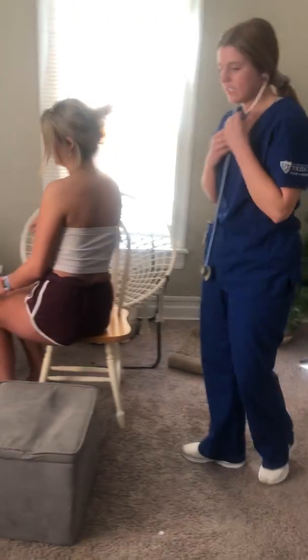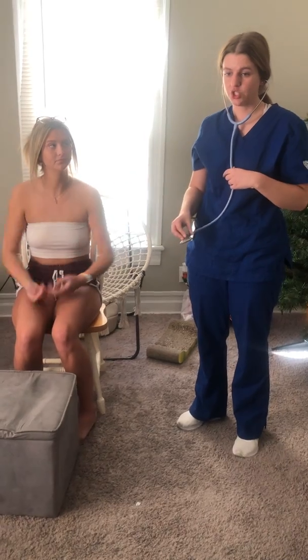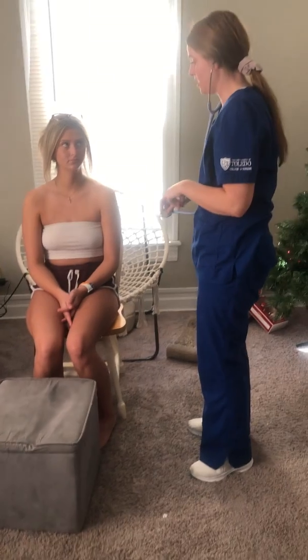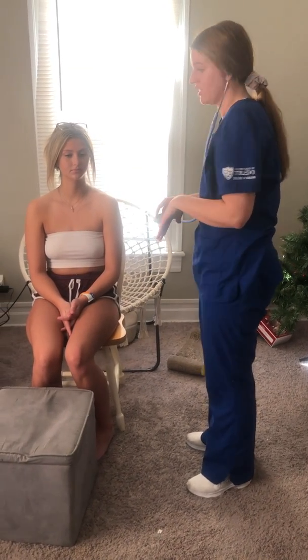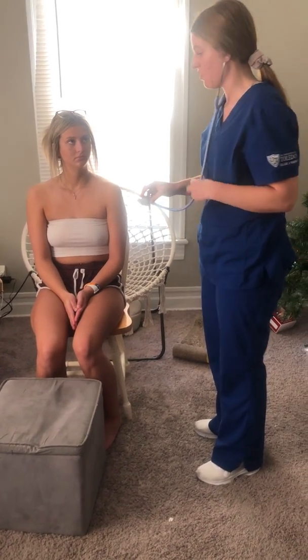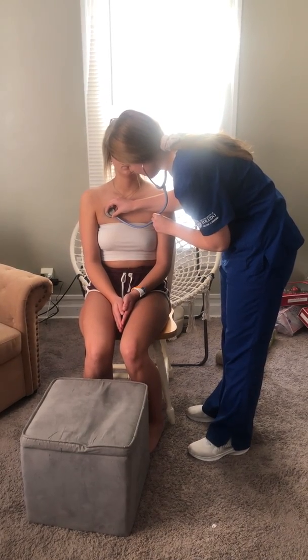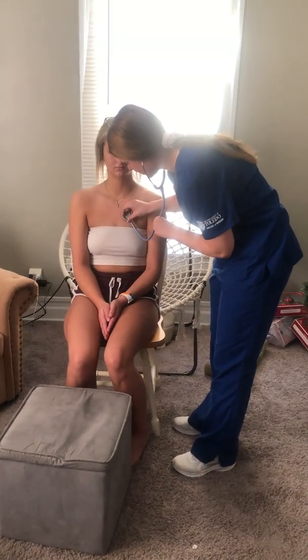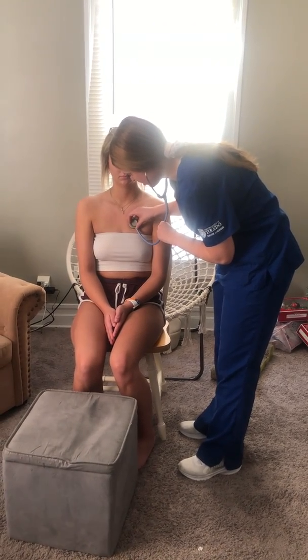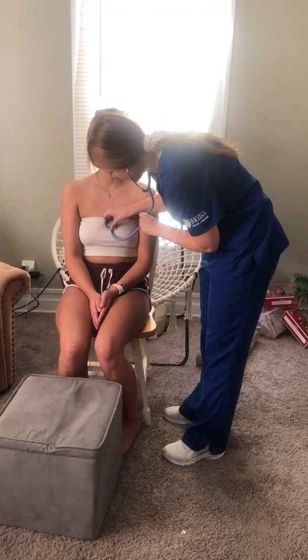All right, so her lung sounds sounded good. I did not hear any rhonchi or wheezing, and now we're gonna listen to S1 and S2 sounds in the 5 locations. So we're gonna start on the right side of the body, in the second intercostal space, which is the aortic. And then we are going to move to the second intercostal space on the left side of the body, which is the pulmonic. And then we are going to move to the third intercostal space, which is Erb's point on the left side of the body.